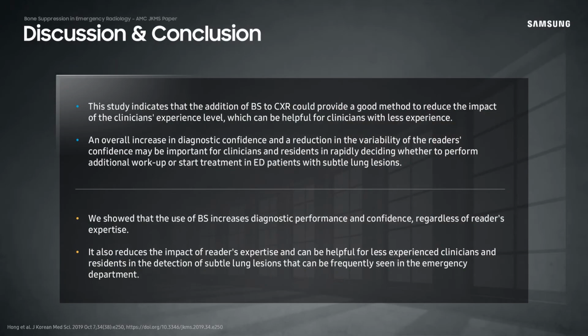In summary, this study indicates that the addition of bone suppression images to chest X-ray could provide a good method to reduce the impact of clinicians' experience level and increase diagnostic confidence. Reducing reader variability can be important for clinicians and residents in rapidly deciding the treatment plan for patients in the emergency department.